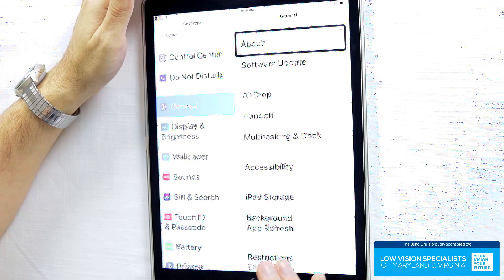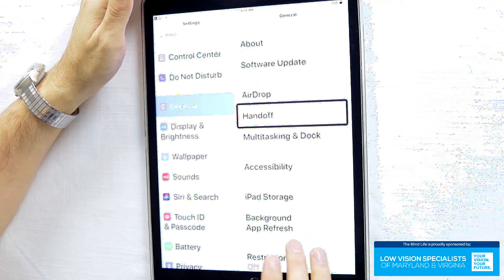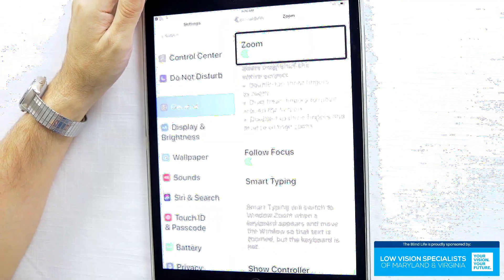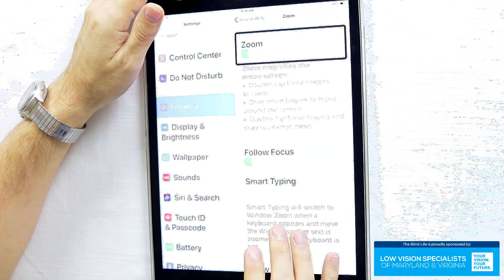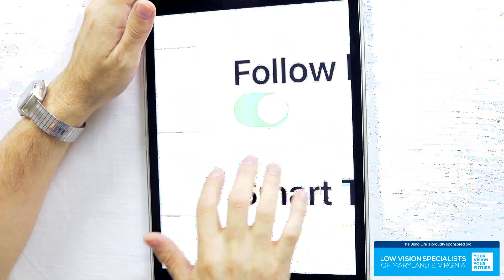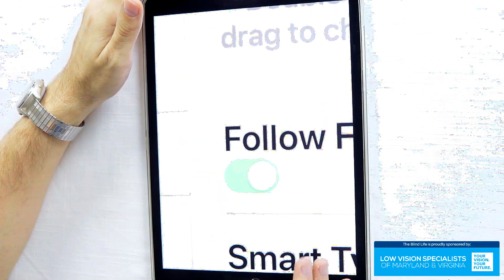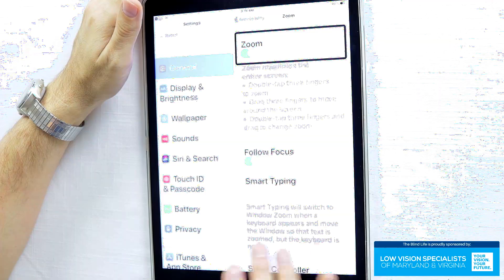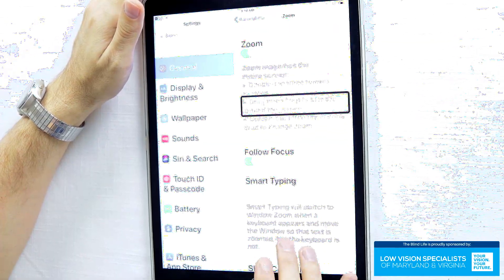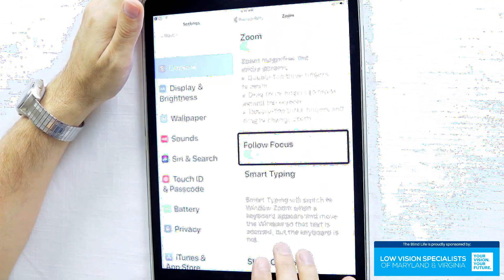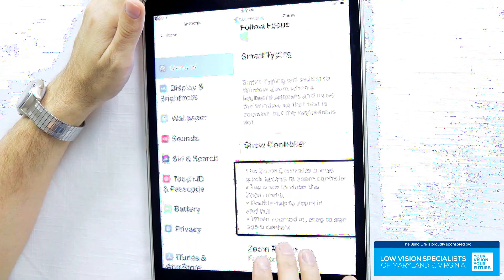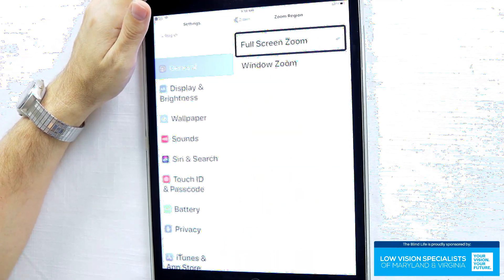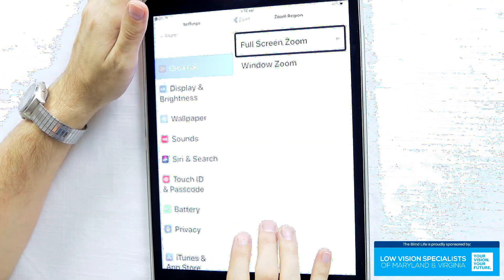Now we're going into the general section so we can get into accessibility. We're going to turn zoom on. When you turn it on for the first time, it's going to pop up in a little window. If you want to do full screen zoom like I do — I prefer full screen, I think it works better for me personally — you'll go to zoom region to switch it. Double tap three fingers to zoom, drag three fingers to move around. There's also follow focus and smart typing. Under zoom region, you can switch between full screen zoom and window zoom, which are the two different styles of magnification.